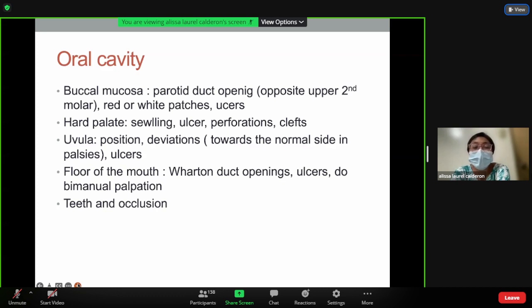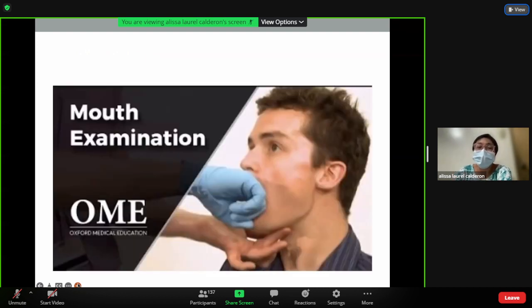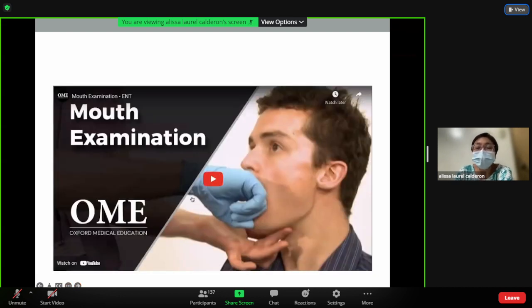Sometimes, with the help of your tongue depressor, you can make the opening of the oral cavity bigger. Check the oropharynx. Sometimes you do your posterior rhinoscopy, and more or less you will have an idea. But in the oropharynx, you are looking at the soft palate, the tonsils, whether the tonsils are there, or if not, then you ask about previous surgery, the size of the tonsils, the crypts, if there are ulcers. Check the posterior pharyngeal wall. Look at the lymphoid follicles and ulcers. Okay, so this is how you do your mouth examination.